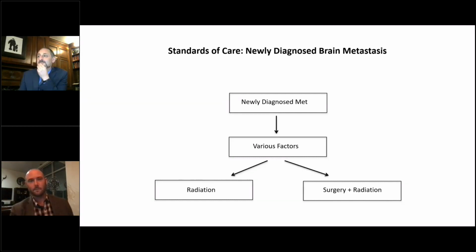So it says, for patients with suspected GBM in which you are pursuing biopsy, for example low KPS or a tough area, is your workflow to go from biopsy directly to LITT based on frozen, or do you come back at a later time? I think that's the huge benefit. You just replace that biopsy needle with your laser catheter right off the frozen. For the most part, the only reason you wouldn't cook something is if the alternative was a non-tumor diagnosis, like MS or something, right? Although who knows, maybe that works for that.